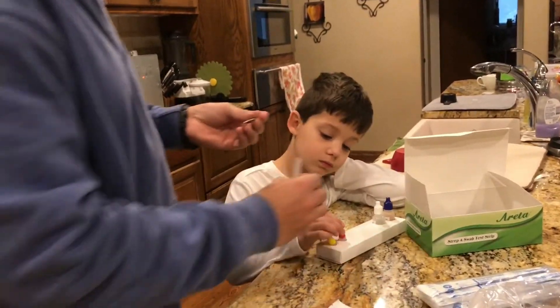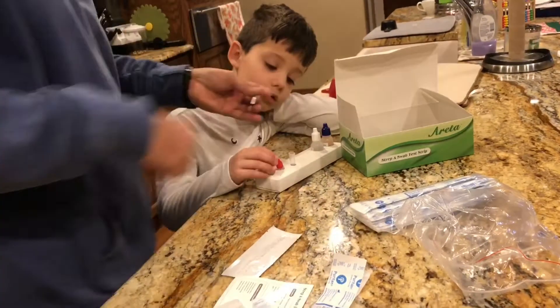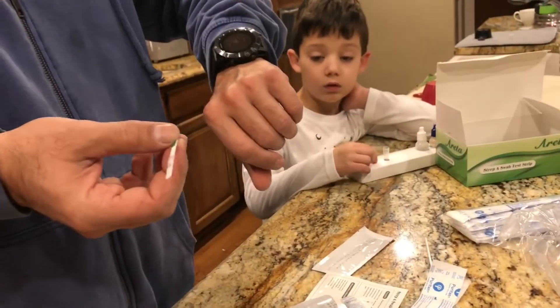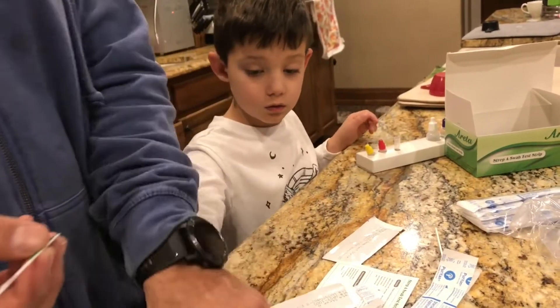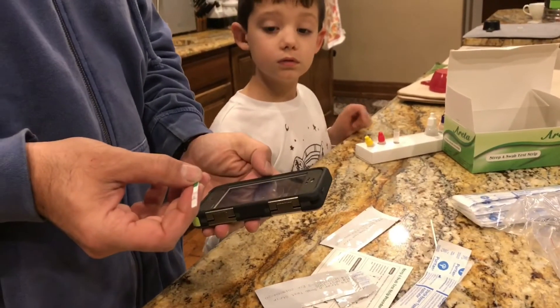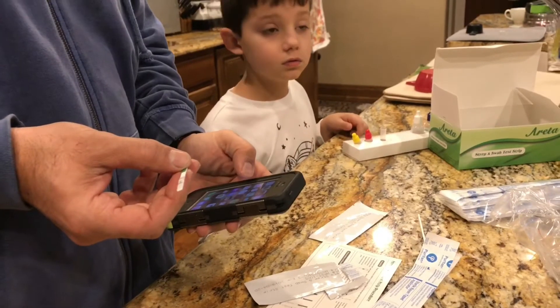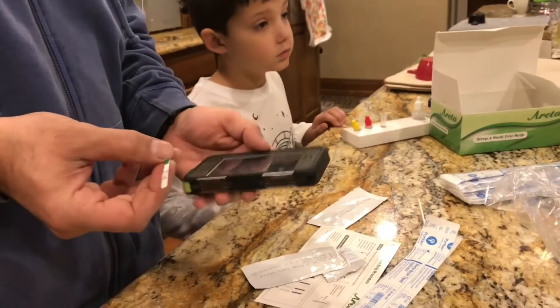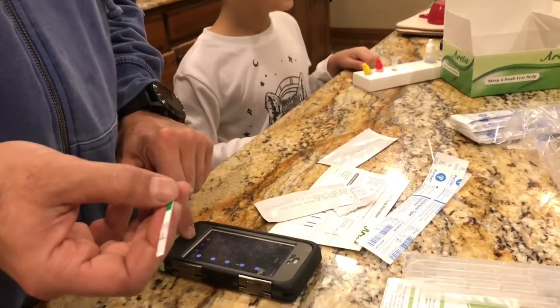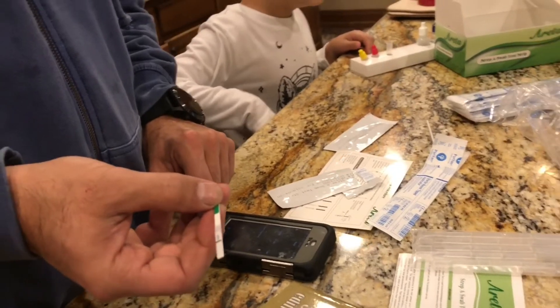Stick it in: one, two, three, four, five — pull it out. Now set this down in the holder. You can use the little holes in the kit to hold the strip. Now we look at the clock because we're going to read this in 10 minutes. If you wait 20 minutes it invalidates the test — if it's negative at 20 minutes you can no longer interpret it. So we need to interpret it at around 10 minutes.